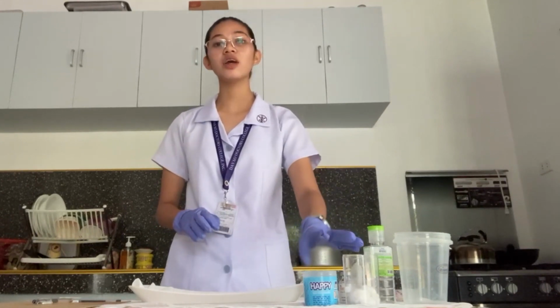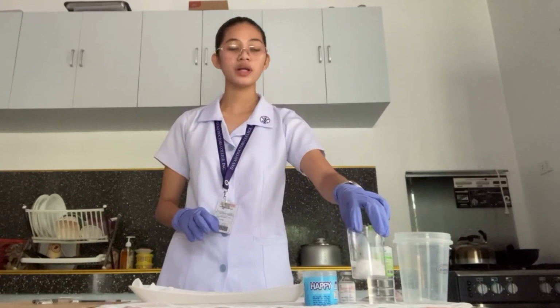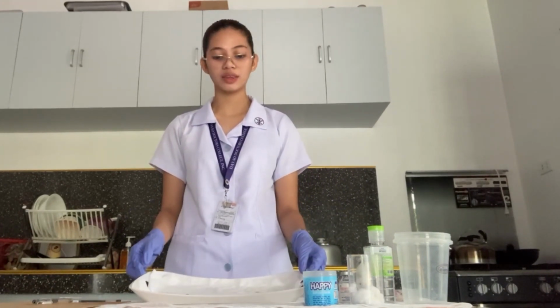We also have here two kinds of cotton balls. The first one is soaked in 70% alcohol. Then the other one is just plain cotton ball, which is dry. We also have here our hypodermic tray, wherein we will put all of our already prepared syringes to be administered to the patient when we bring it to the patient's room.